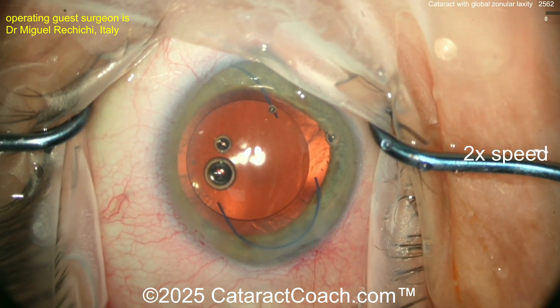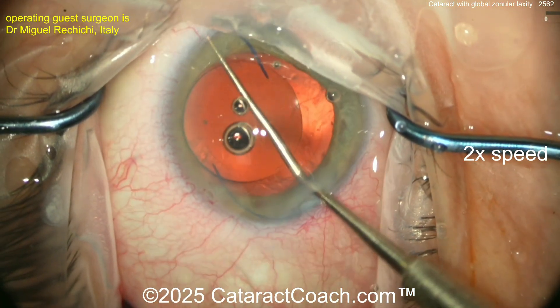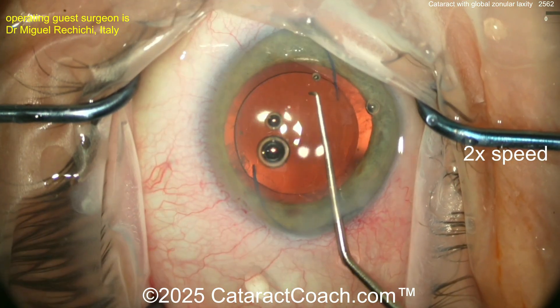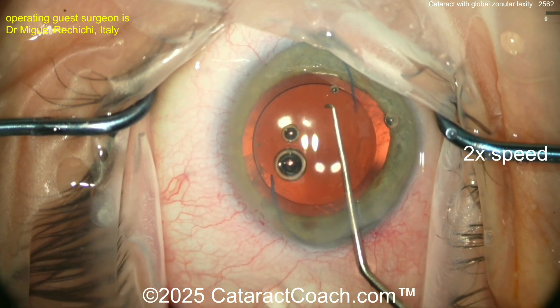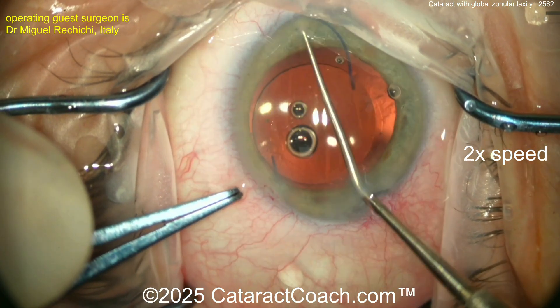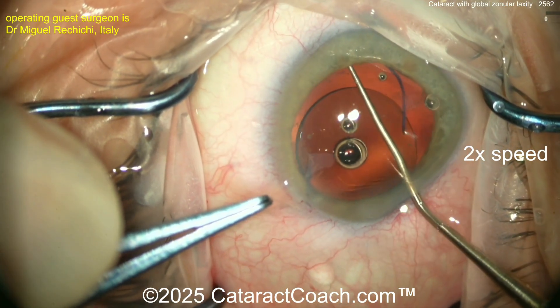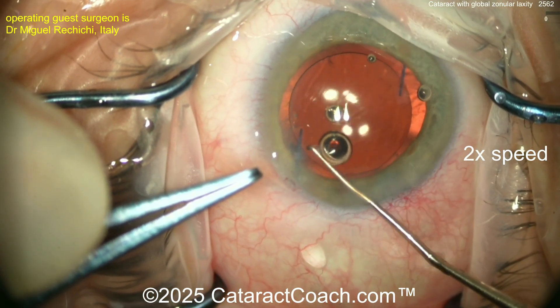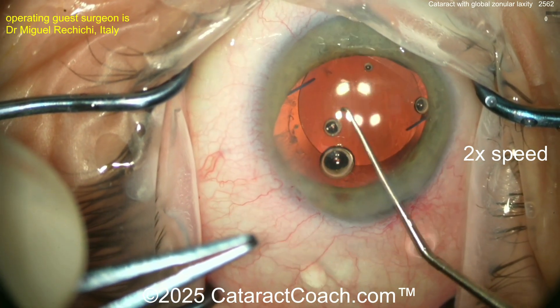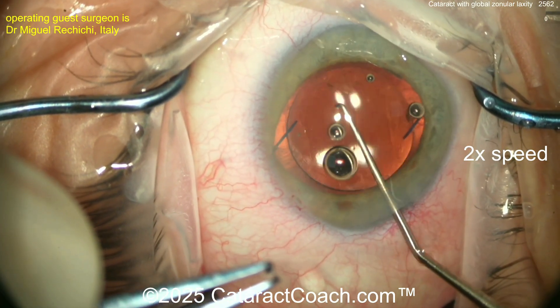When the capsule bag is held open by the CTR, haptics in the sulcus, and the optic goes behind the capsulorrhexis as a buttonhole through there. Keeping that optic behind the capsulorrhexis prevents the anterior capsule from becoming phimotic. Get the Sinski hook and place that haptic where you want it — nicely positioned. Dial it a bit and get the other haptic placed in the sulcus. Then optic capture — that will give great long-term stability.